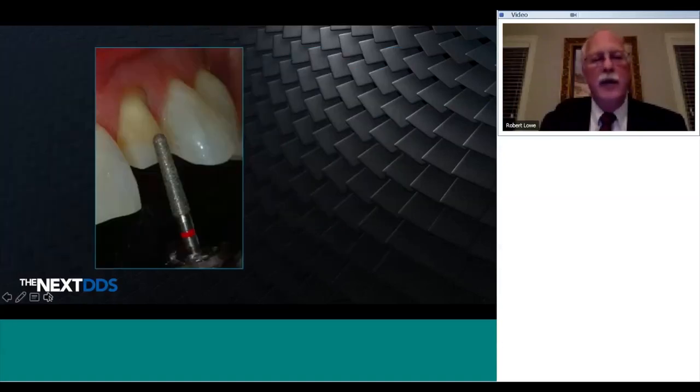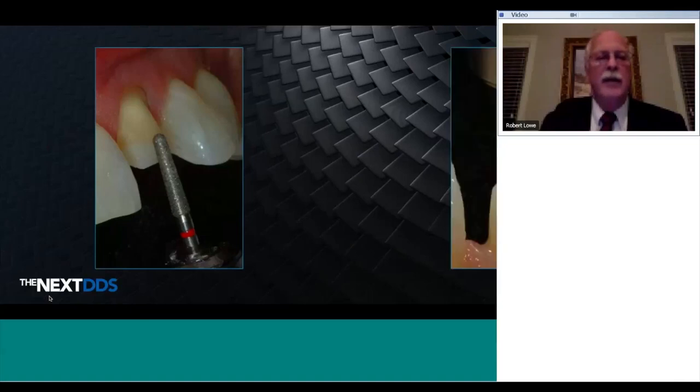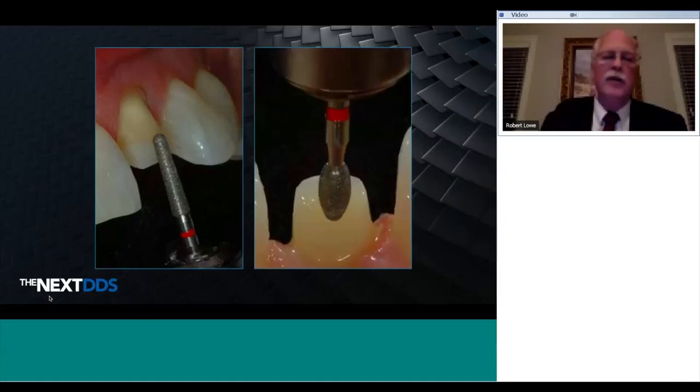I always smooth my preparations with a fine diamond. The smoother the prep, the better. In today's world of CAD/CAM, it's even more important to have a smooth preparation.